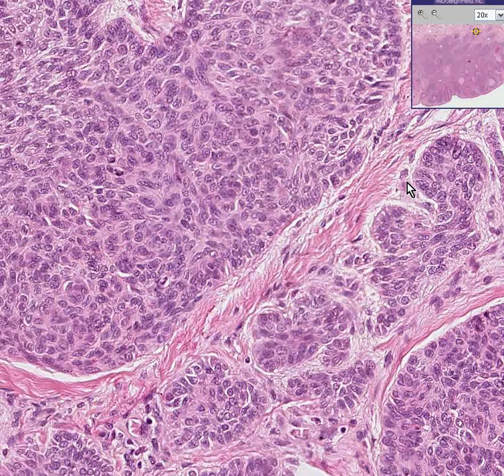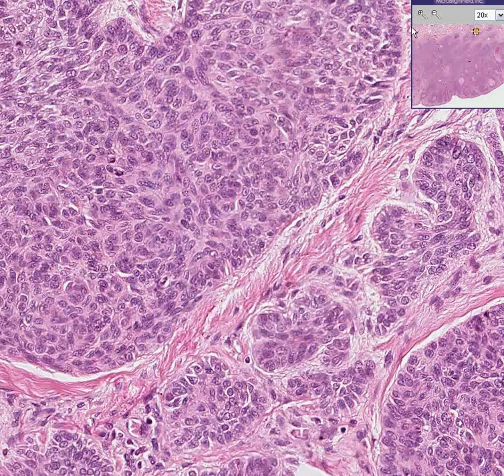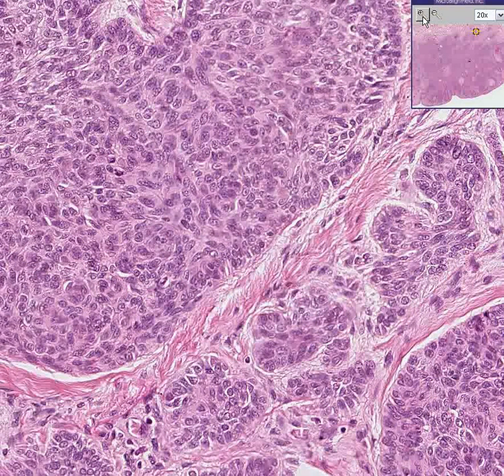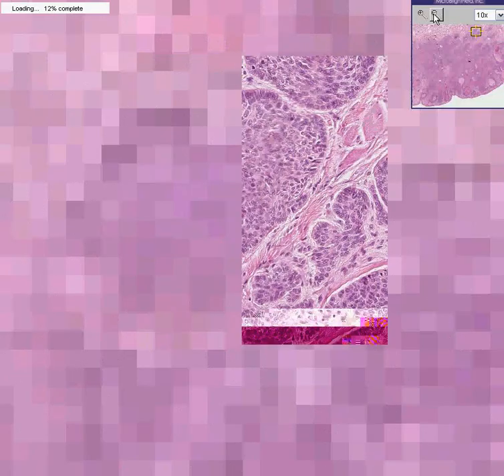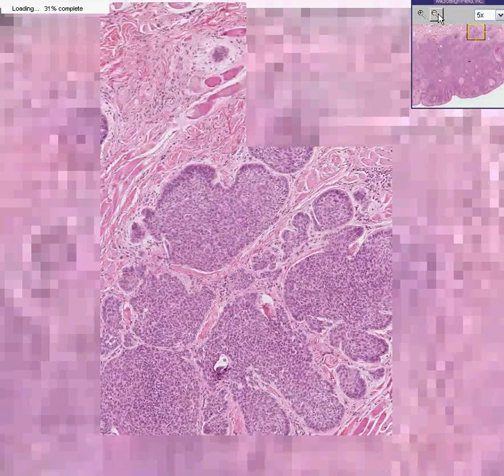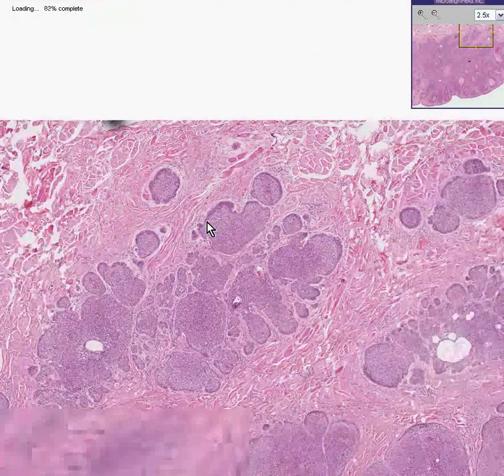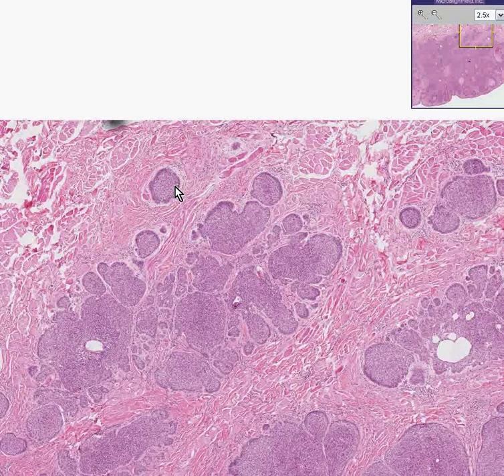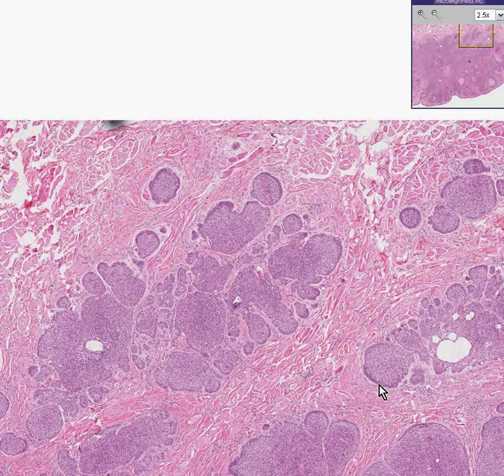Here's an irregular nest, but it's still palisaded. That's why this tumor looks very, very blue — it doesn't make too much keratin. Again, any primary skin epithelial tumor that has these features — you can even see the palisading from this low edge power, right here.